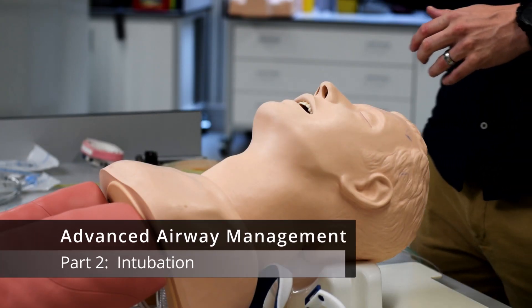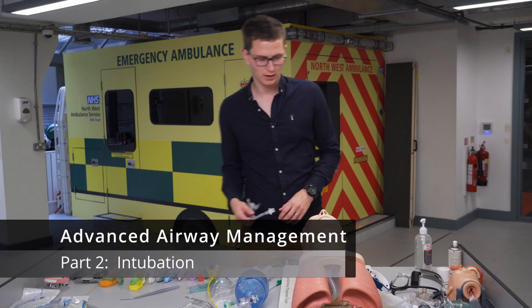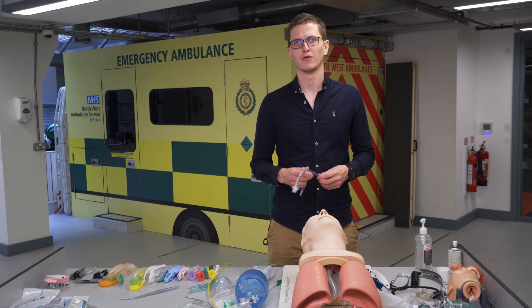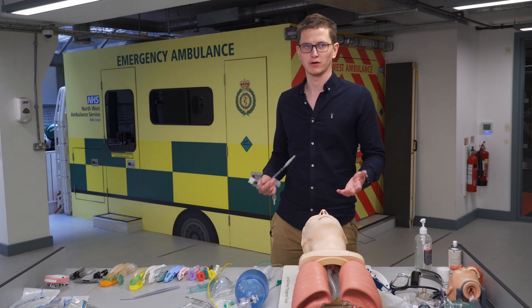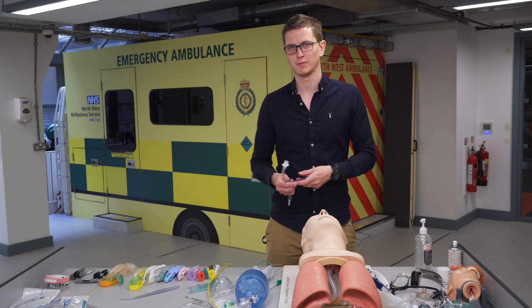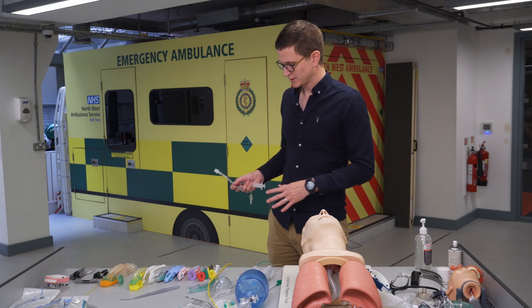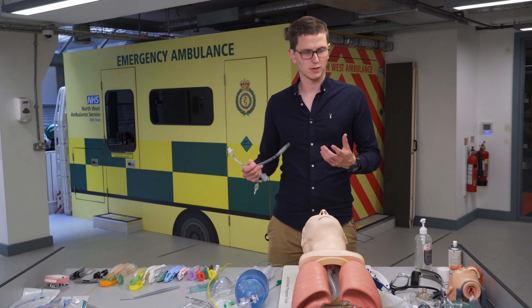Now we're going to talk about endotracheal intubation — the pros and cons and how to do it. We'll be referring to intubating a patient in cardiac arrest, not drug-facilitated intubation such as RSI. Let's go through the pieces of equipment needed.